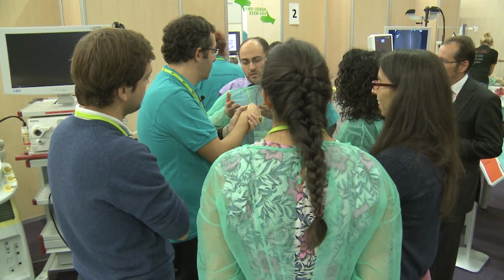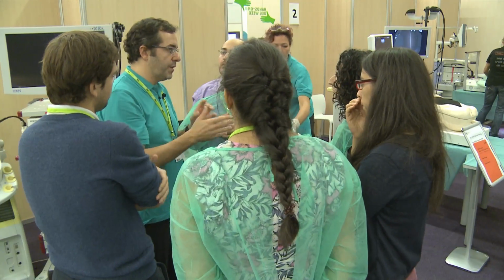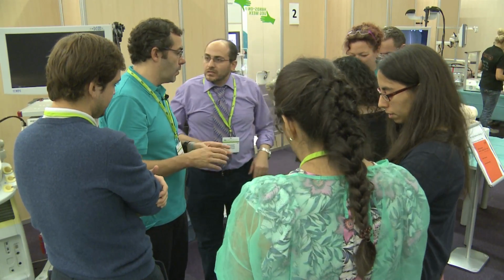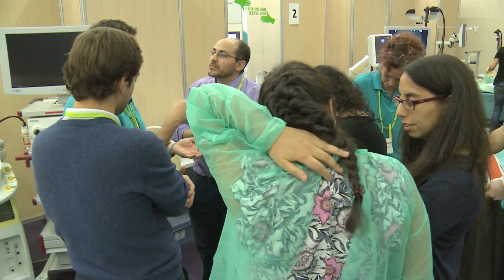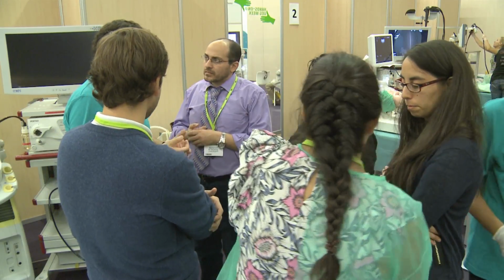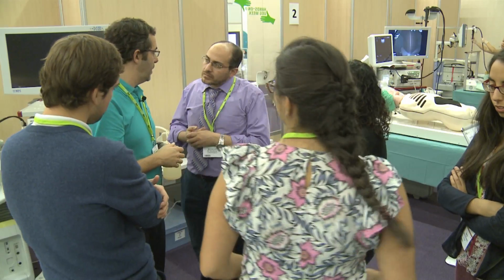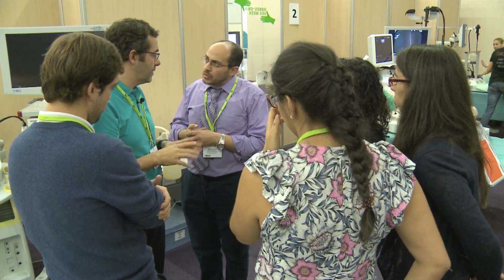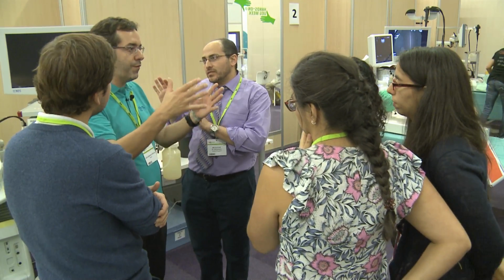So that the lesion appears from the mesentery when the surgeon comes? No, that's for the laparoscopic approach. Yeah, because they're going to remove it laparoscopically, but they need to see the lesion. So you inject ink into the lesion? Yes, with the normal systems for bleeding, I mean the normal catheter. I used to do it by EUS because it's very simple. I'm with the scope inside, so I just place a little bit of ink and leave it for the surgeon to remove by laparoscopic surgery. That is our approach for submucosal lesions, when we're speaking about big ones, 3, 4, 5 centimeters.